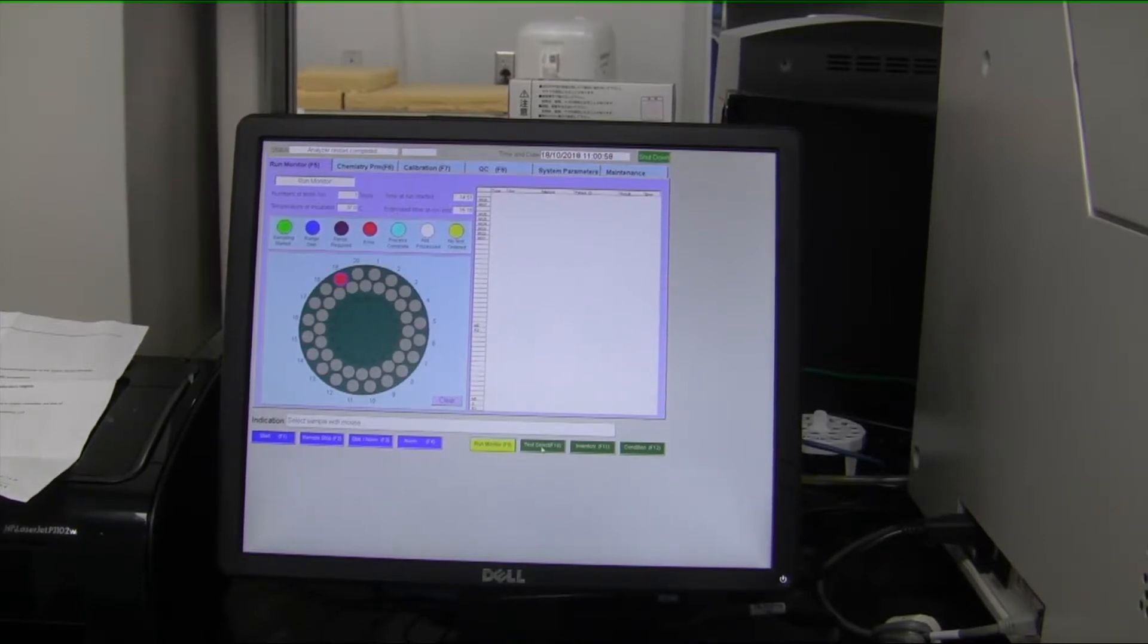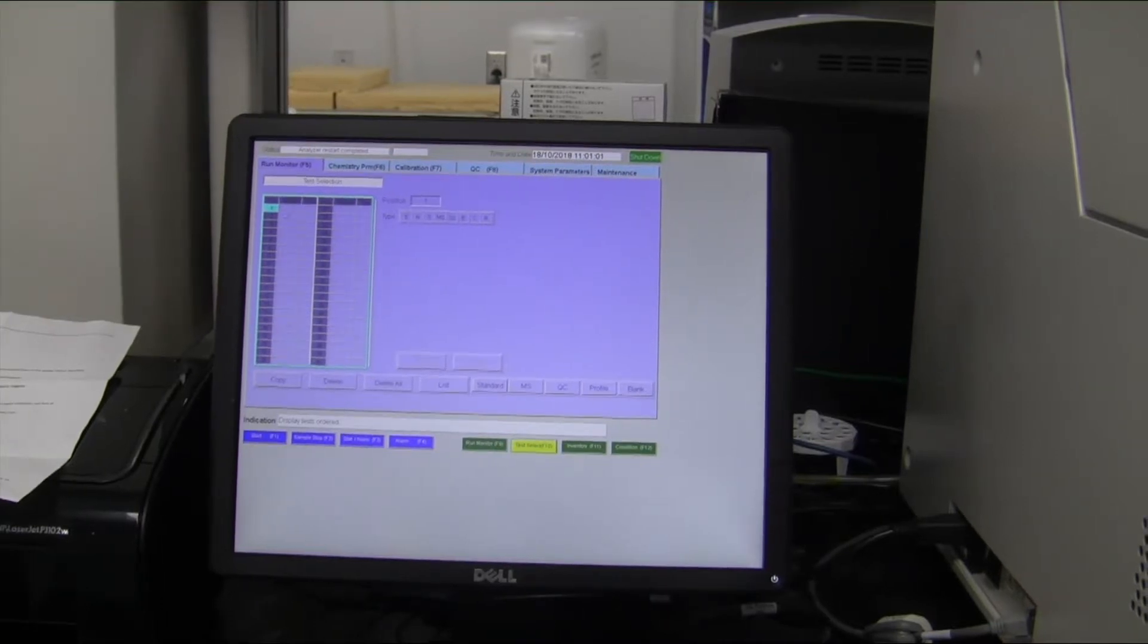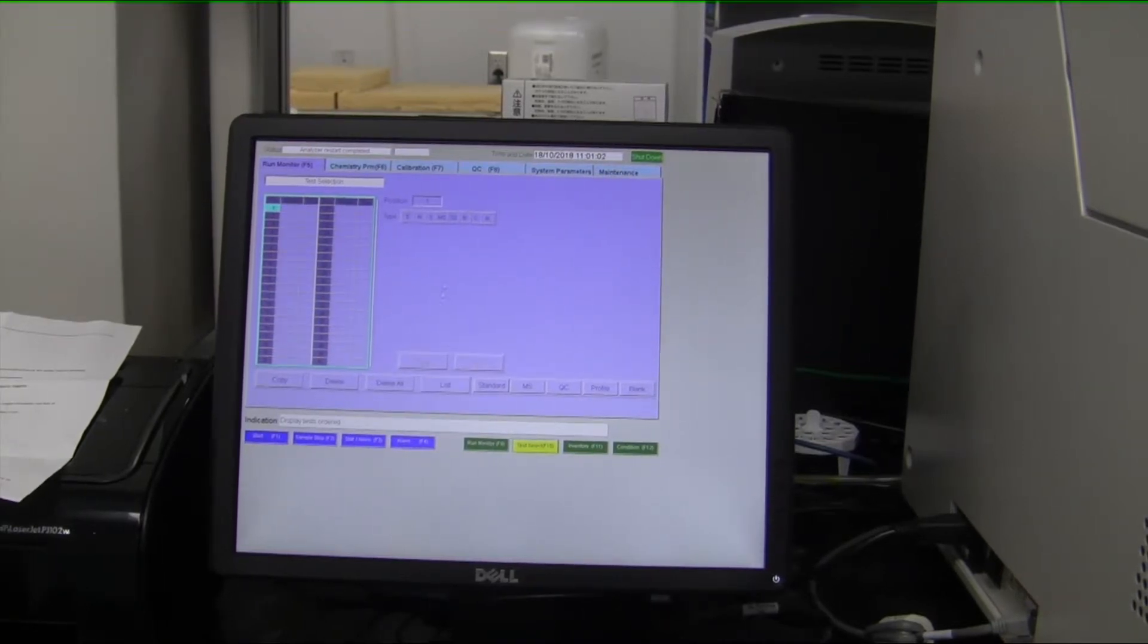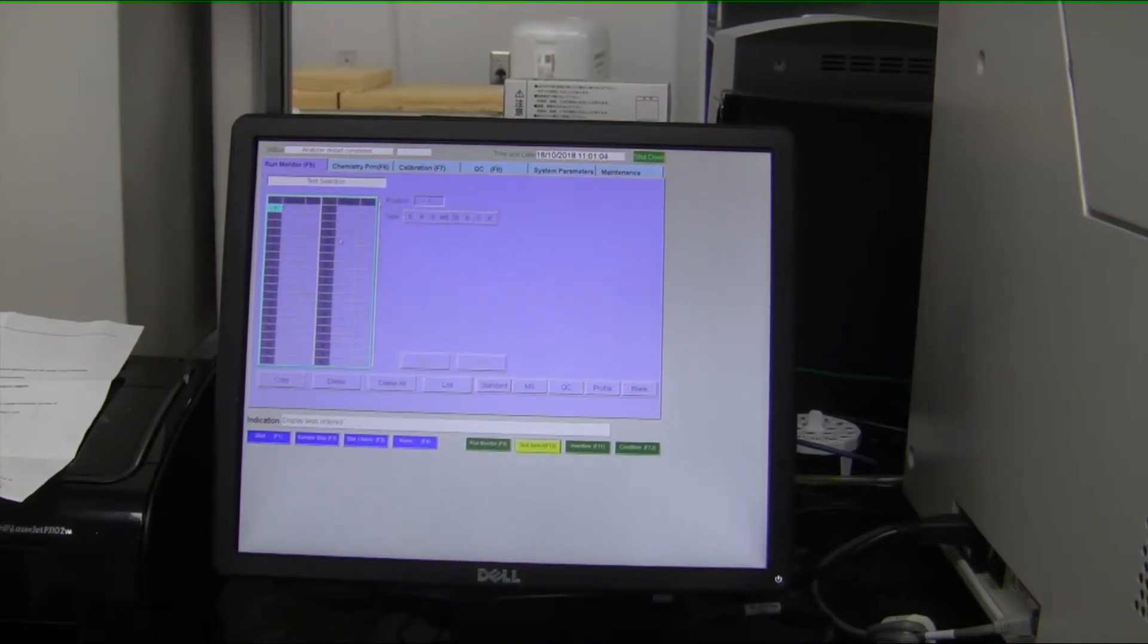Under Test Selection, you would enter in all your samples, whether it be an unknown sample or a normal sample type.